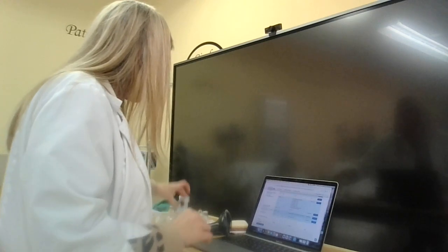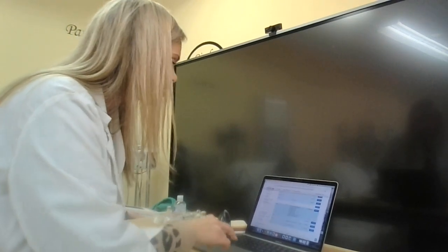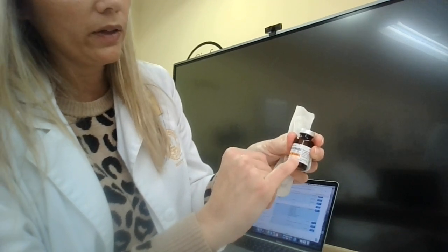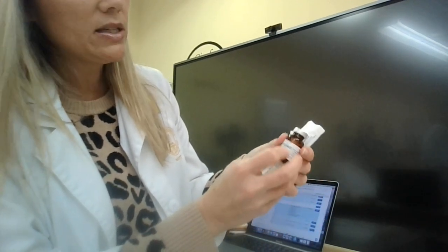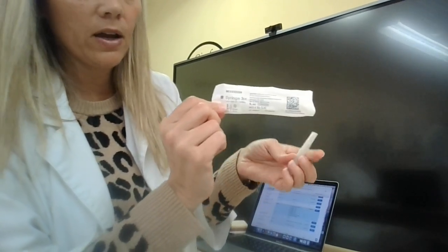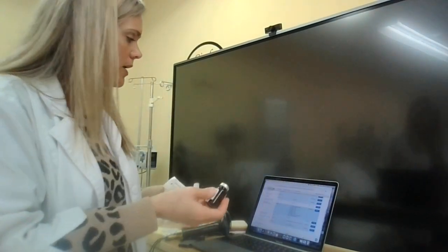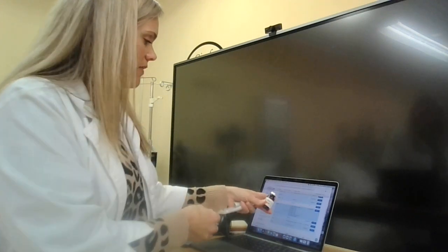So I'm going to go ahead and grab that Lasix. And I know to draw it up, it looks like I'm going to be giving this patient 20 milligrams of Lasix. And when I look at this, I can see this is 100 milligrams of furosemide or Lasix, and it's 10 milligrams per milliliter. So I'll need to know how many milliliters I'm drawing up to choose the appropriate size syringe. So if I'm giving 20 milligrams, I'll need 2 milliliters. So this 3 milliliter syringe will work perfectly. For that, I'm going to be using a blunt tip needle, and that's just to draw it up and to keep the end sterile because we'll be giving this directly IV push. Okay, so check 1, I've got Chris Jones, furosemide or Lasix, 20 milligrams. I'm going to be giving it IV push today at noon.